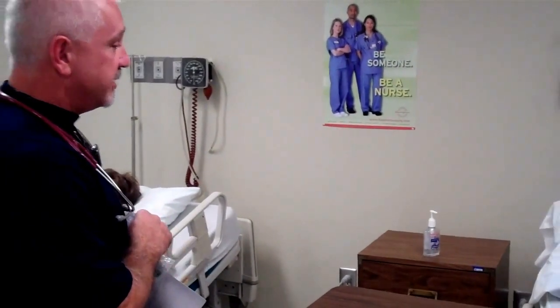Hi, my name is Alan, I'm from Respiratory Care, and your physician has ordered some oxygen for you to help you breathe a little bit better. And your name is? Savannah Hatch. Savannah Hatch, okay, great.